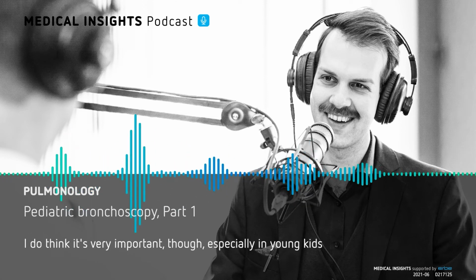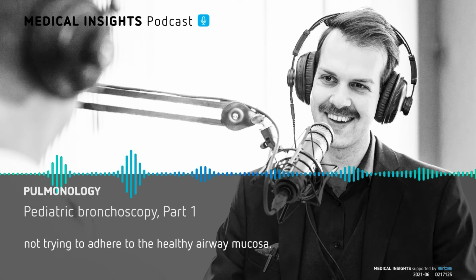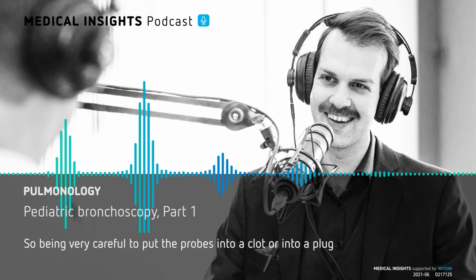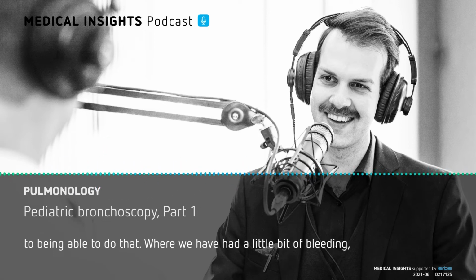I do think it's very important, though, especially in young kids with small airways, to make sure that you're not trying to adhere to the healthy airway mucosa. So being very careful to put the probes into a clot or into a plug or another object that may need to be coming out of the airway is critical to being able to do that.